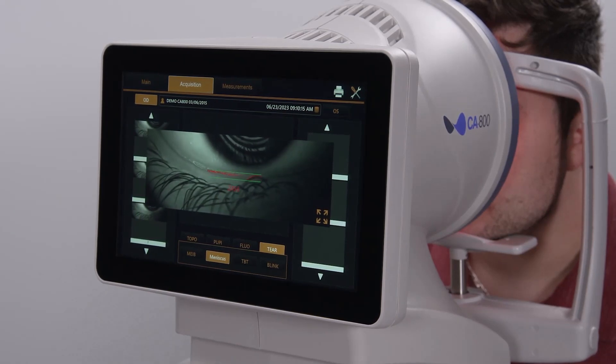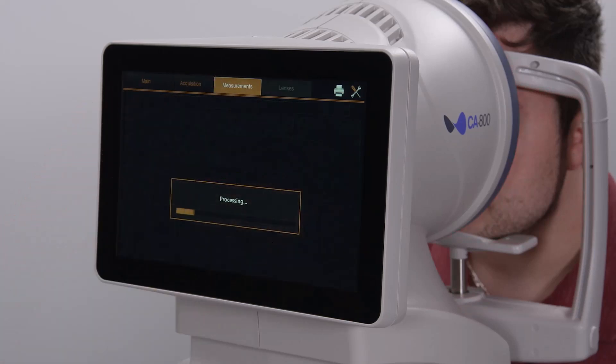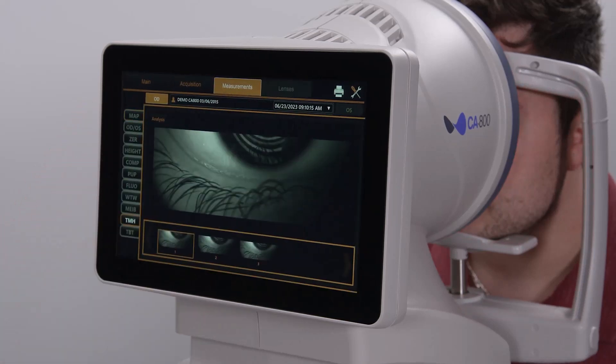The tear meniscus height can be analyzed via the Measurements tab. For more information, please go to topconhealthcare.com.